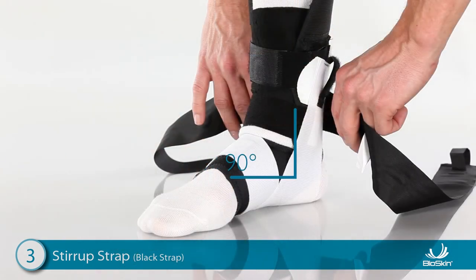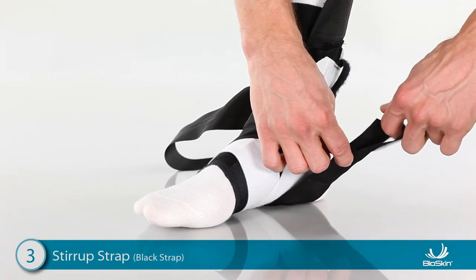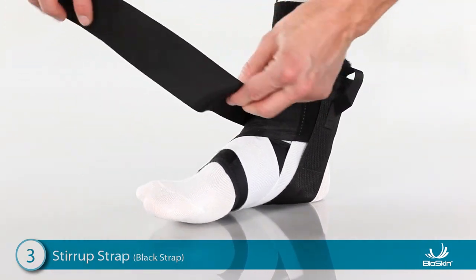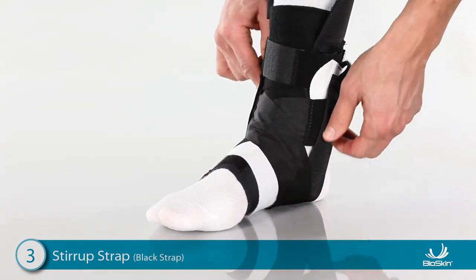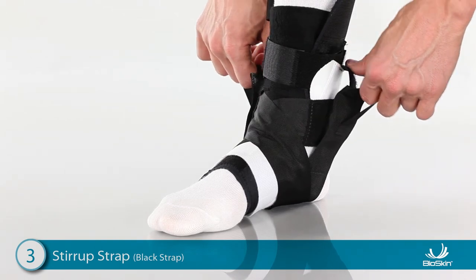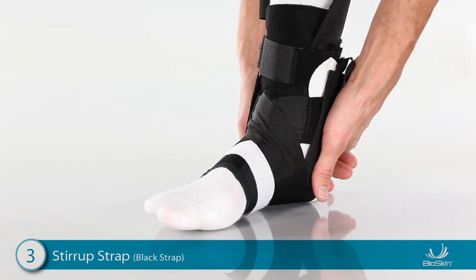Next, position the foot at a 90-degree angle and wrap one side of the strap over the front of the ankle, then wrap it under the heel and attach high on the ankle. Wrap the other side over the front of the ankle, then wrap it under the heel and attach high on the ankle. For increased stability, use the finger loops to detach both tabs, lift the toes up, pull up firmly on the straps, and reattach.